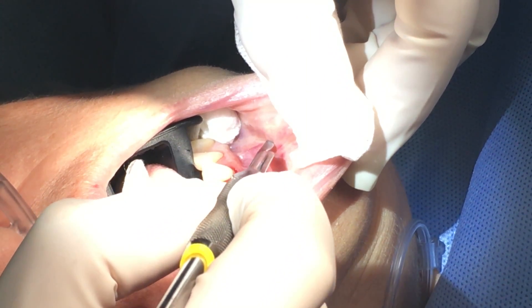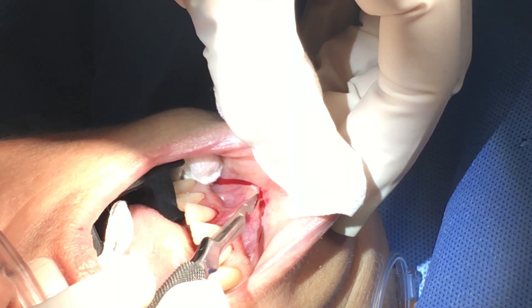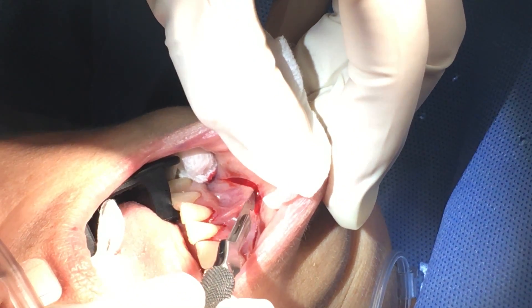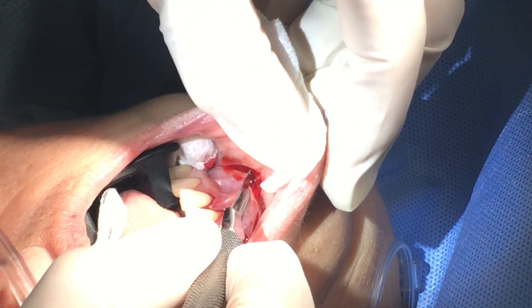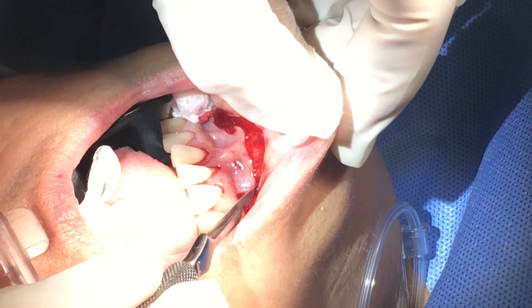I'm going to want a nice large sweeping incision. It's a very superficial incision because the point is not to go into muscle, but just to dissect the mucosa itself. You can see how the tension just starts to release itself.